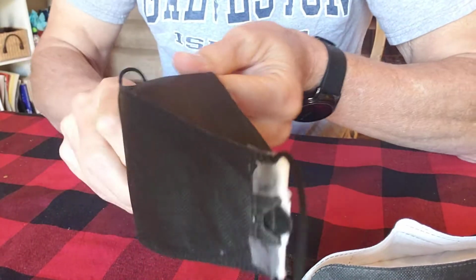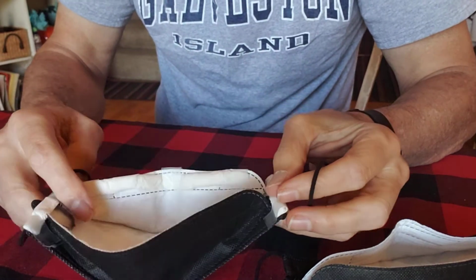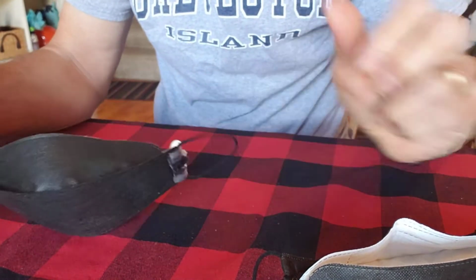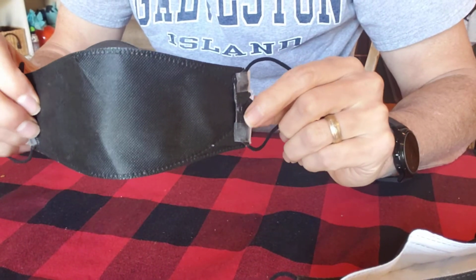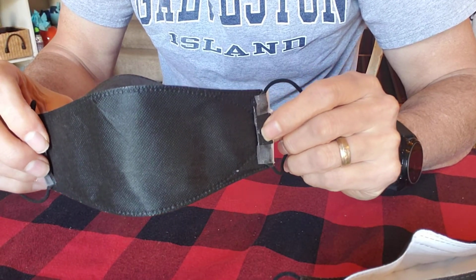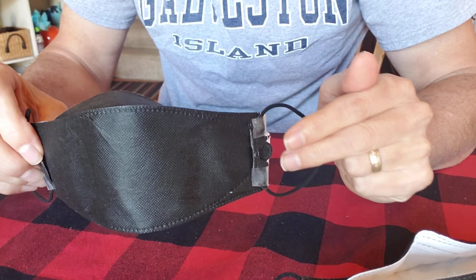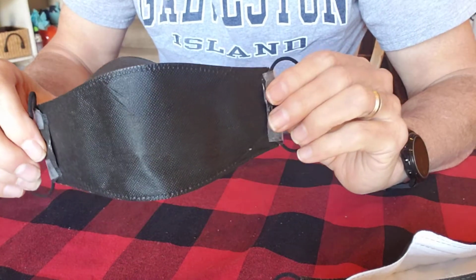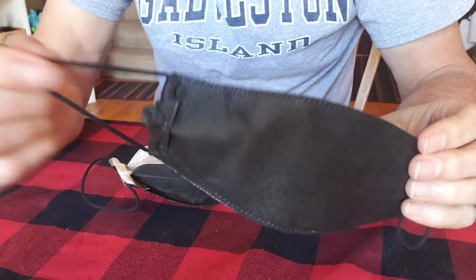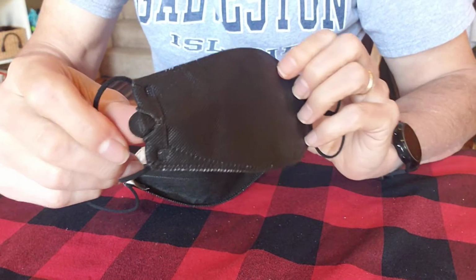And so I have some more to say about this Bluna face fit, which basically has these loops that you use for adjusting. Normally you're supposed to grab the loop from the center and pull it out, and that's how you adjust it. But I didn't like that because when you do that, it actually pulls back in over time and it loosens, so I didn't like having to adjust that. I wanted to adjust it once. So the next thing I tried was tying a loop in the end of the ear loop rather than pulling it out here, and that had an undesirable effect.